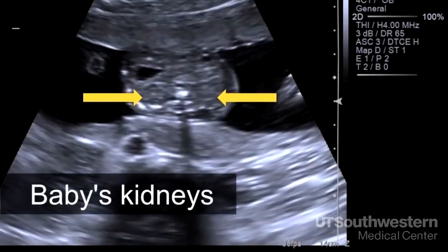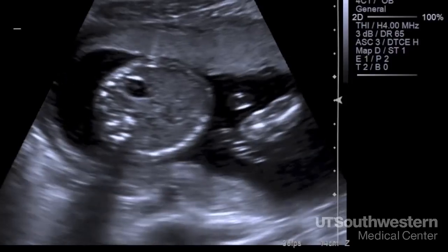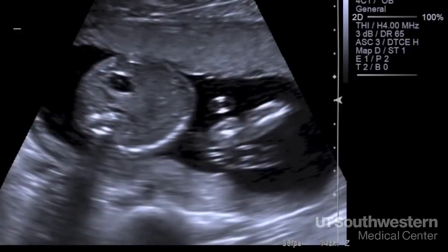The kidneys sit next to the spine and are hard for me to point out to people and show them that they're normal. Here we're looking at a cross-section of the abdomen at the level of the waist. The black dot is the baby's stomach, and it shows up as black because it has fluid in it. The fluid is amniotic fluid, which the baby has swallowed. So seeing it there tells me that the baby is swallowing, which is an activity that should be happening.